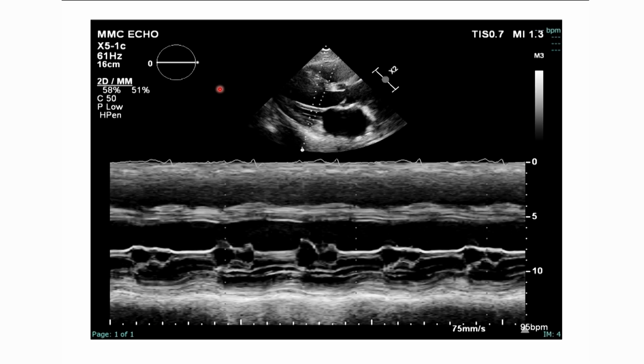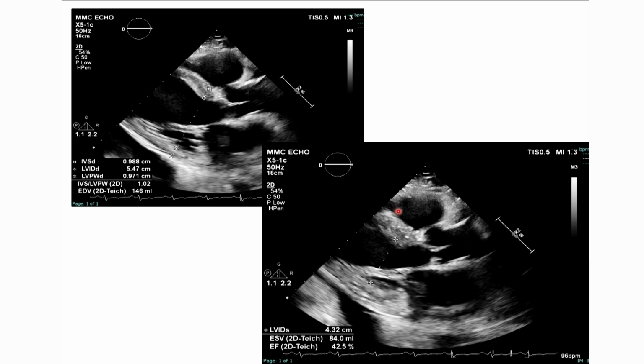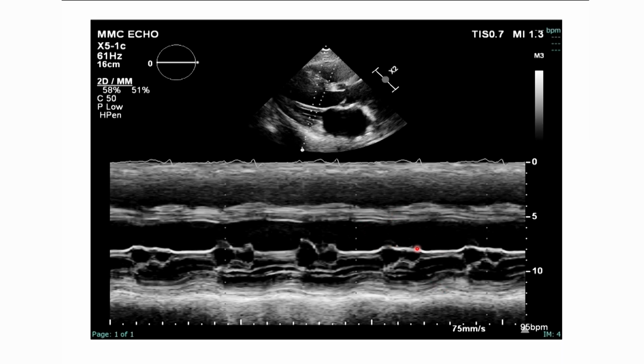We also, if we look here, not as classic, but we might see a little bit of diastolic fluttering on this mitral valve by M mode, because what's happening is that regurgitation is just hitting that anterior leaflet. It's restricting it in diastole, making it difficult for it to open. You actually even see it kind of get pushed down a little bit here, right?